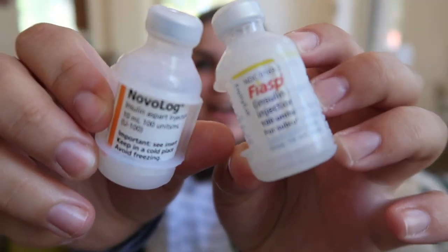Last but not least: insulin. I carry Fiasp and Novolog. I carry Fiasp because it's supposed to be really quick acting, so if I need an injection I'll use Fiasp. I carry my Novolog for when I need to do a pod change, since this is what I put in my pod.